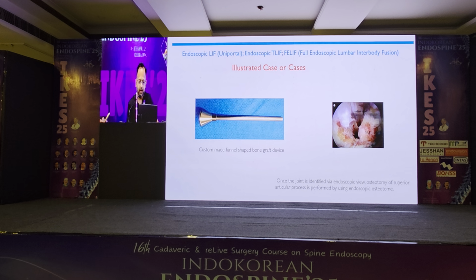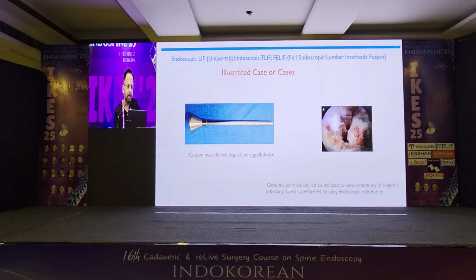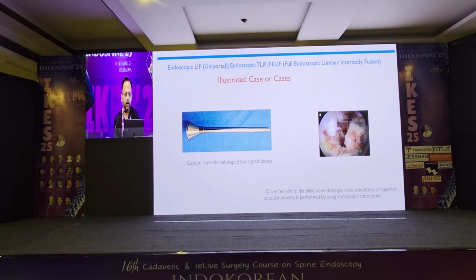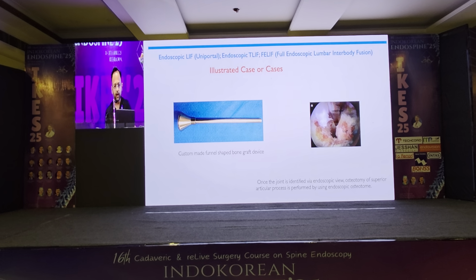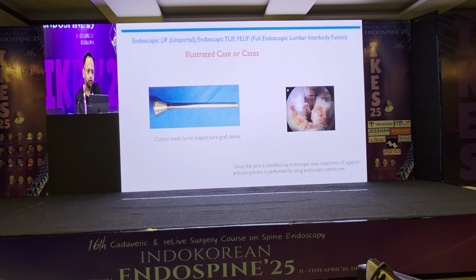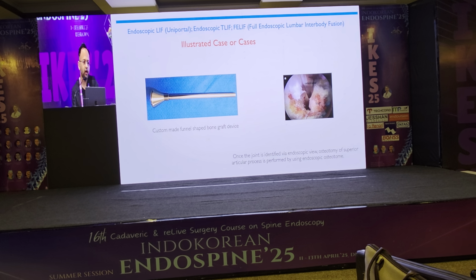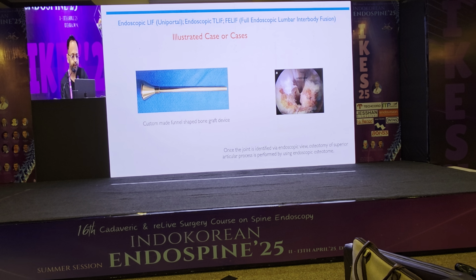This is one more funnel required to pack the autograft, as the surgeon is showing. We get en bloc facet resection. The facets can be taken with a chisel or a drill. We follow something called en bloc: we remove the complete IAP parts and the lamina together. So we get a good chunk, at minimum around 8 to 15 grams of bone autograft, which is good enough. You don't need iliac crest autograft, which is costly, or BMP or osteogenic products, or bone graft from the posterior spine.